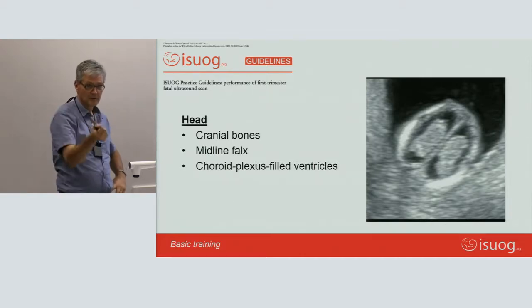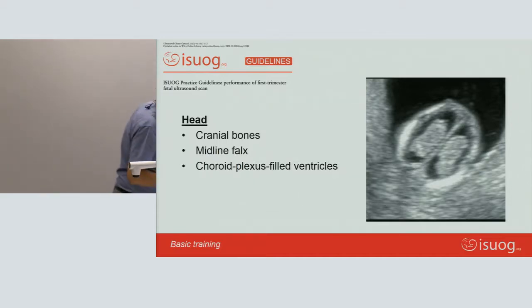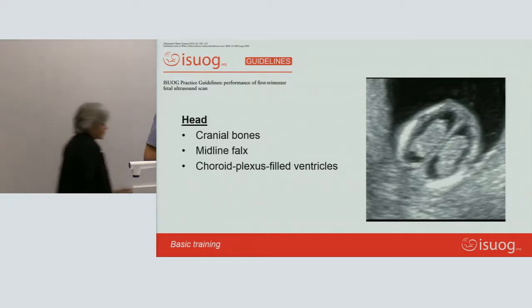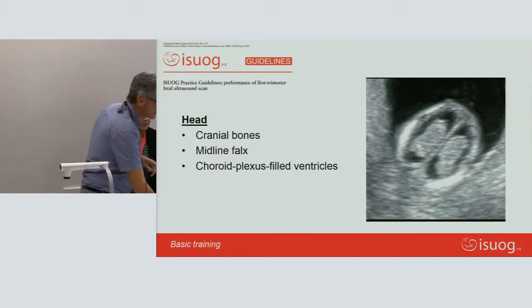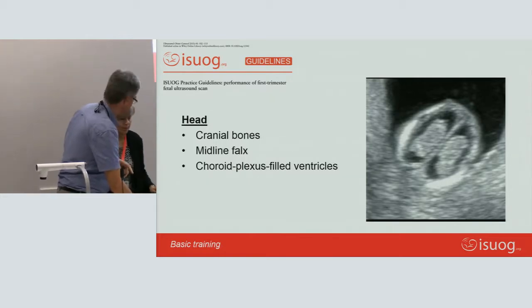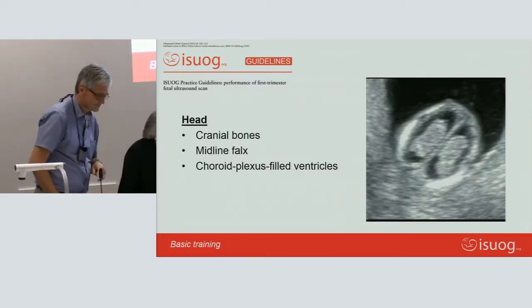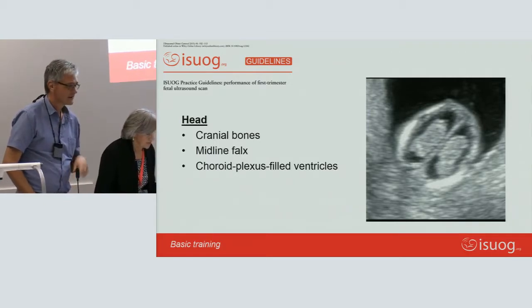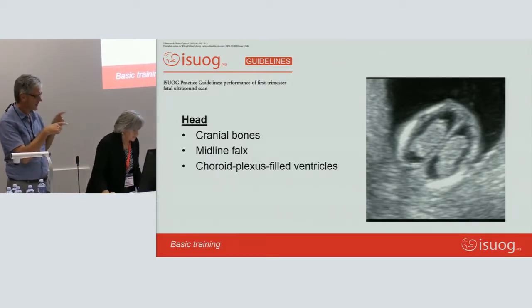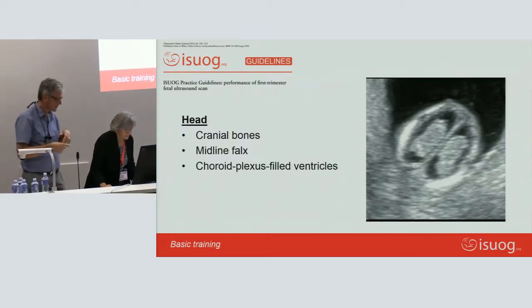Yeah, so it can be that you're scanning the baby incorrectly. This one. Okay, it's just different here than there. Oh yes, it's just that what I see on the screen and what's on top differs.